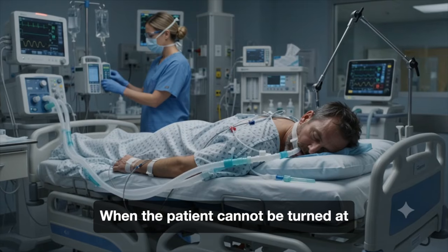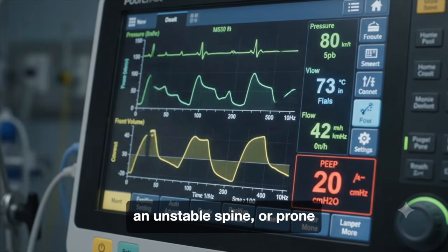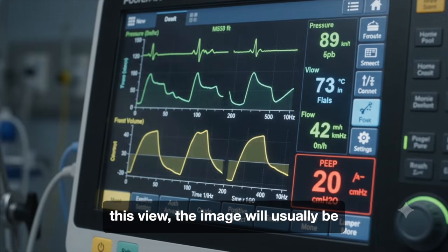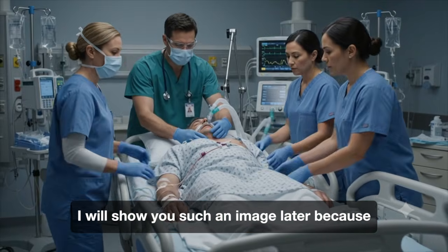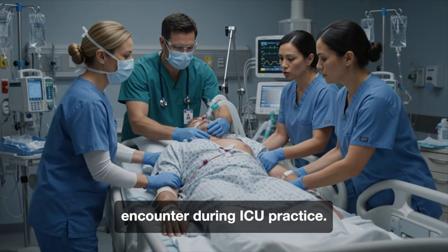When the patient cannot be turned at all, perhaps because of high PEEP, an unstable spine, or prone positioning, you may still be able to obtain this view. The image will usually be deeper and you may require more gain. I will show you such an image later because that is the type of image you will frequently encounter during ICU practice.